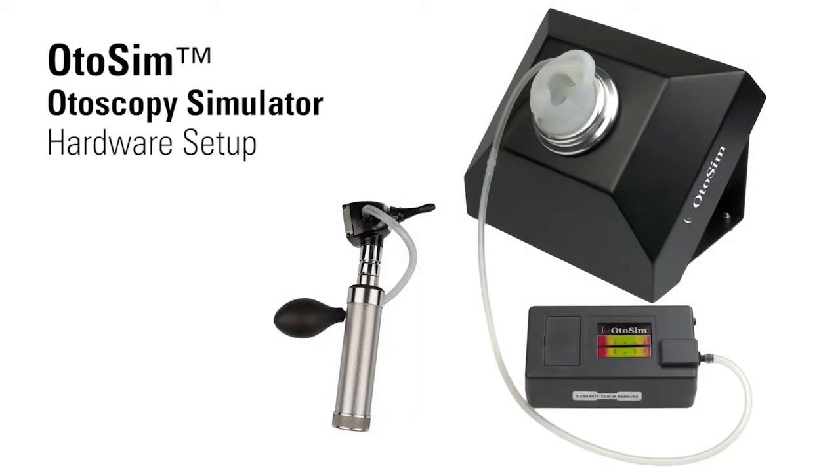In this video, we will demonstrate how to set up the hardware components of the OdoSIM. We recommend that you install the OdoSIM software before setting up the hardware. Please refer to the video segment on software installation for more details. However, you will require the fully connected hardware before you can access the OdoSIM software. Let's begin.